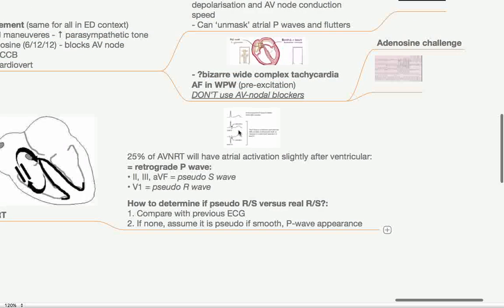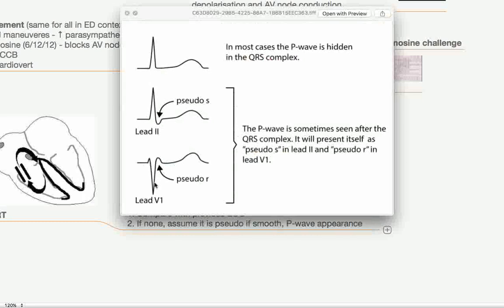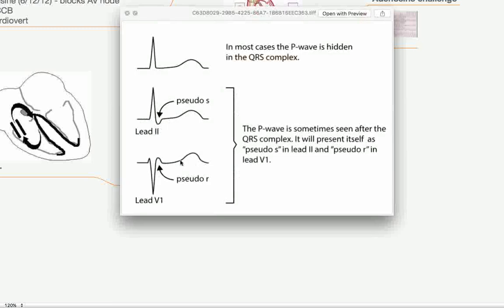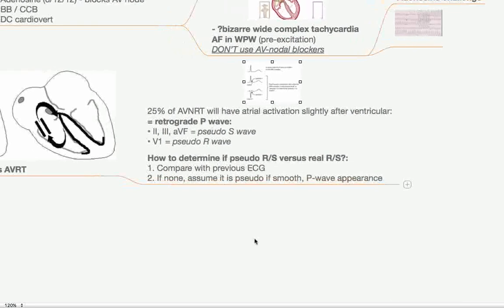And these are actually known as pseudo R waves or pseudo S waves illustrated here. In lead one, you might have sort of an RSR. And actually, that's not really an R wave because you can see it's not as spiky. That's actually a P wave. Similarly here in lead two or three or AVF, you might have an R and then an S. But actually, is that an S? Nope, it's a pseudo S. So that's actually a P wave coming after the QRS. But it's kind of buried in. So it's difficult to see. And if you want to try and figure out, is this a pseudo R wave or a pseudo S? Was it a real R or a real S? Then compare that ECG with their previous ECG. And if there aren't any ECGs, assume it is pseudo if it's a smooth P wave appearance. Because your P waves typically tend to be quite smooth and rounded. They don't tend to be spiky like this. So you could assume that it could be a pseudo wave.